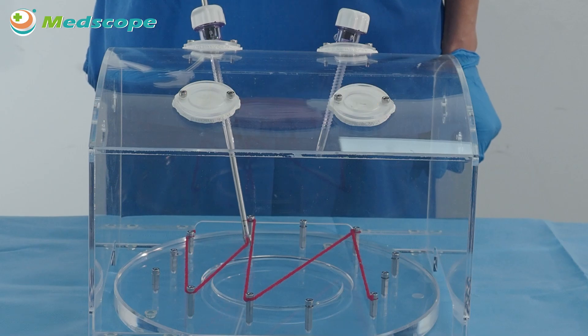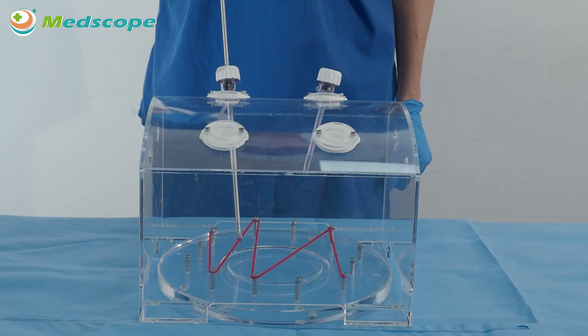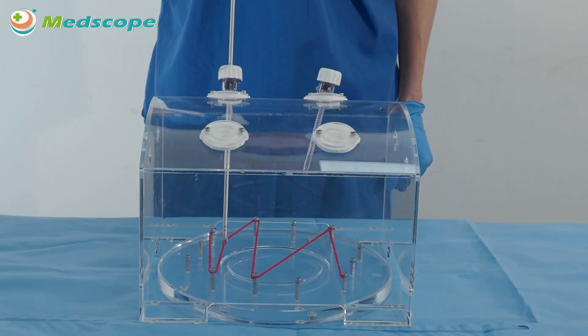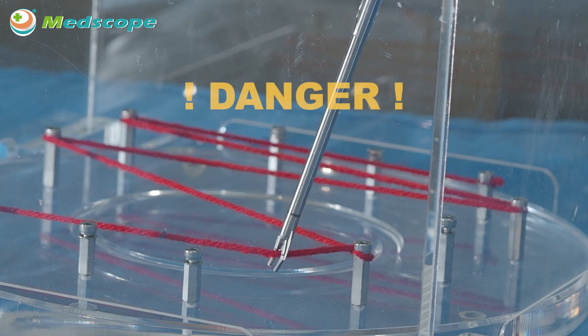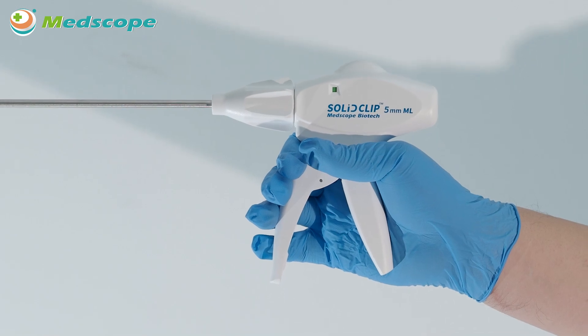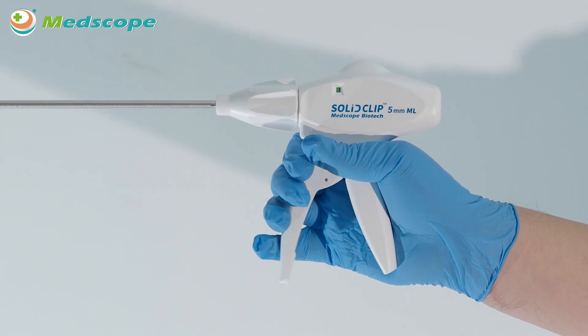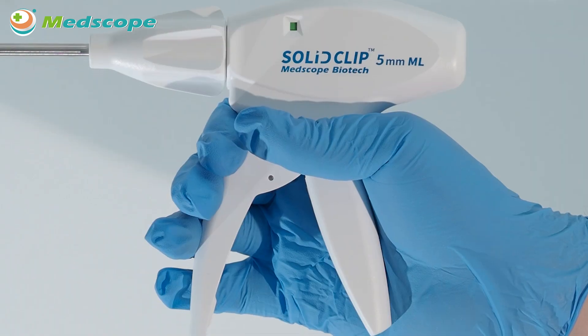Do not excessively twist the jaw or overload it with tissue when firing the clip. Do not apply too much lateral load to the jaw; otherwise, jaw deformation may occur and will result in undesirable firing of the clip. When squeezing the trigger to fire the clip, ensure the trigger is pressed all the way back to the end and touches the handle.